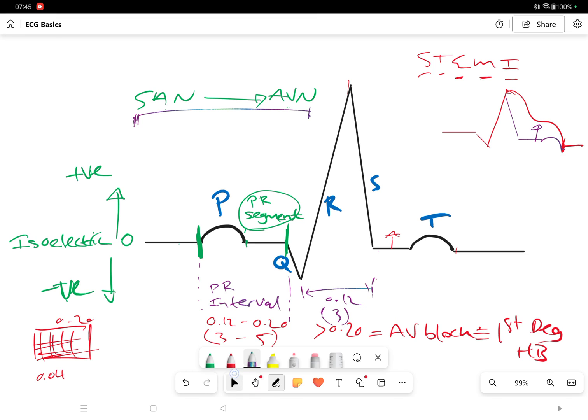And again, why is that important? Well, this becomes important in situations where you get widening of the QRS complex, and you can get widening in situations when we get something called right or left bundle branch block. Remember, new left bundle branch block in a patient should be investigated because it can indicate an MI in cases. So there you have the right bundle branch block. What is right bundle branch? What is left bundle branch?